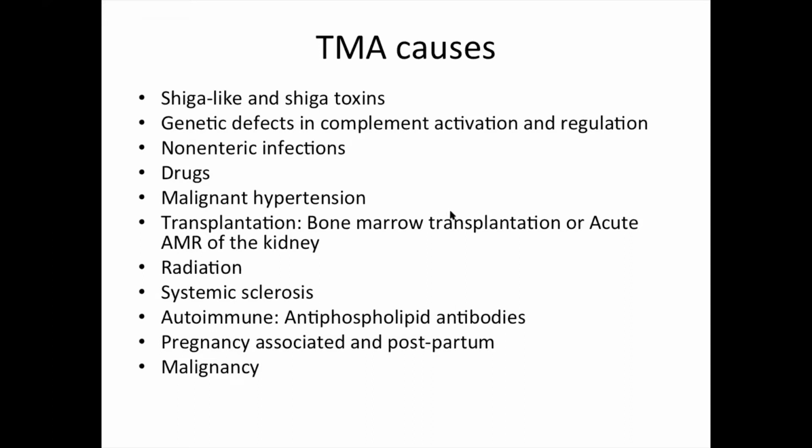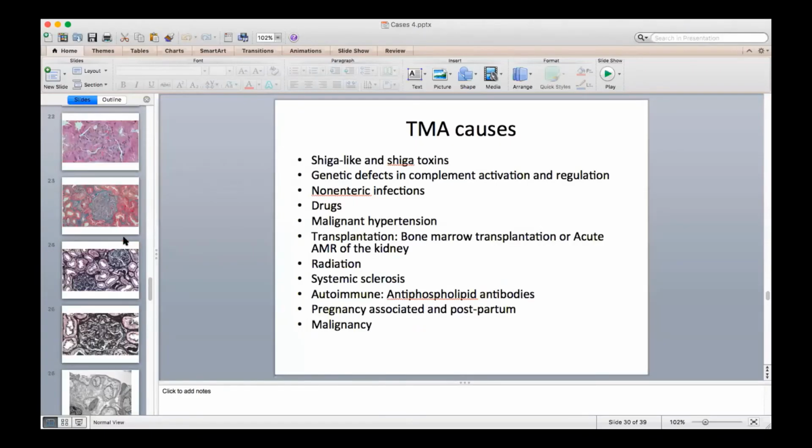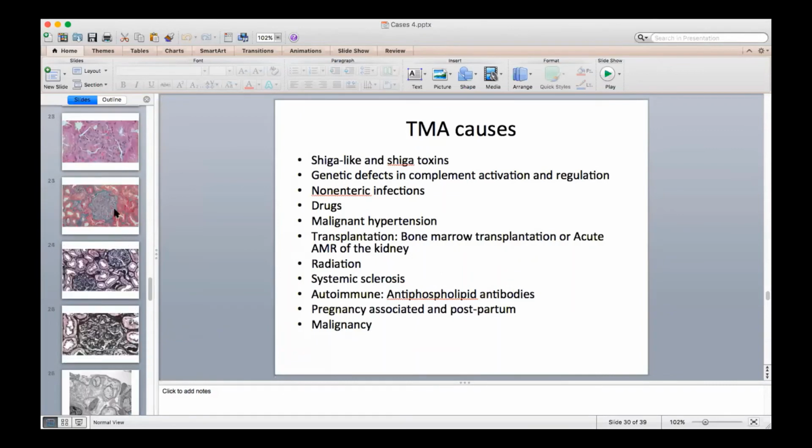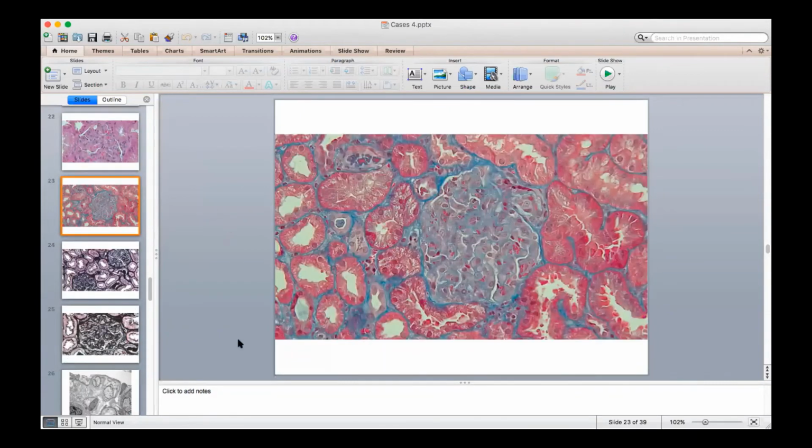Mesangiolysis, how it appears on H&E, let's go back. It's just watery, really. When you see lots of renal biopsies, you'll be able to appreciate it.